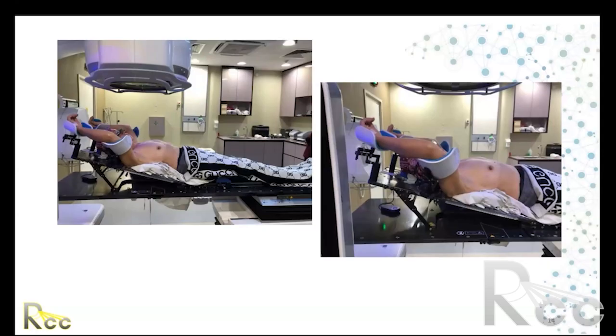Excuse me, do you mean that we don't use this incline immobilization for 3D conformal therapy? Yes, we do still use this immobilization, but the exact angle is less critical. How much of an angle do we use? I think ours is usually set at 15 degrees. Okay.